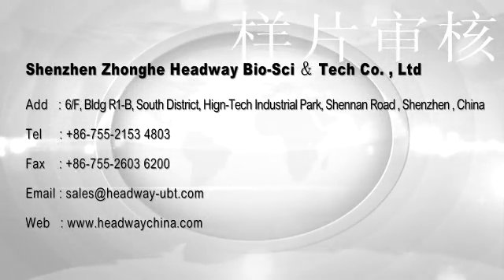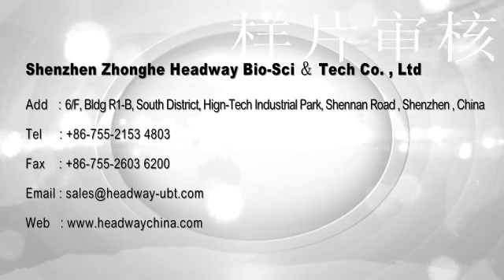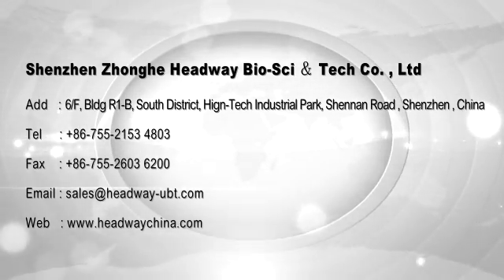For more information and questions about the HUBT20 Helicobacter pylori detector, please contact us freely.